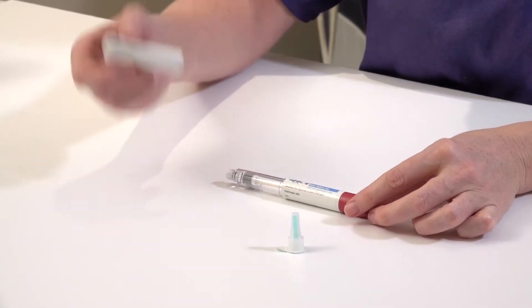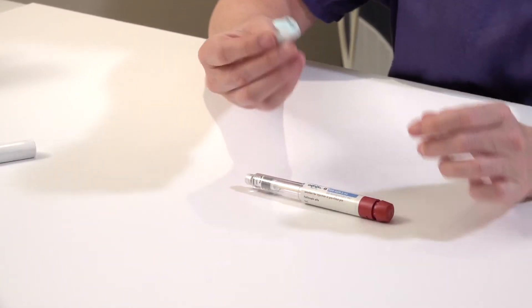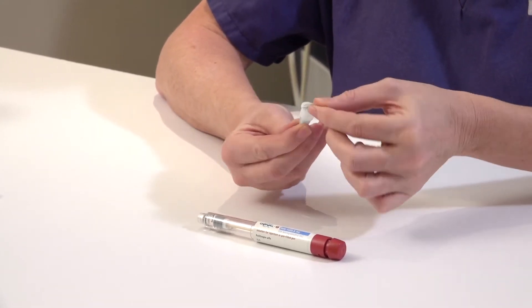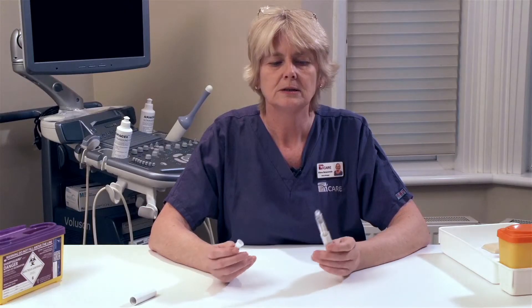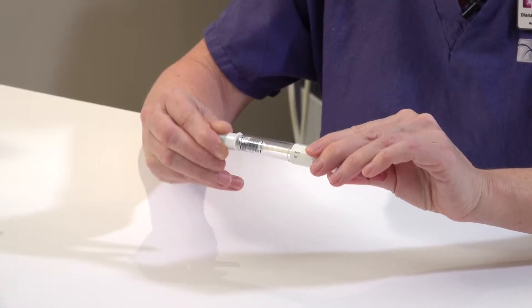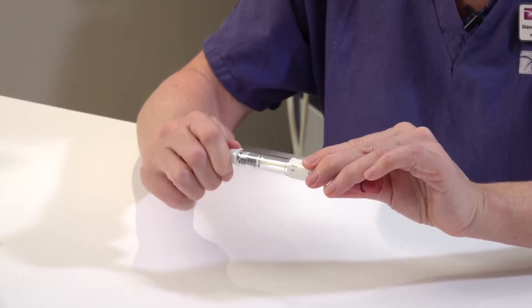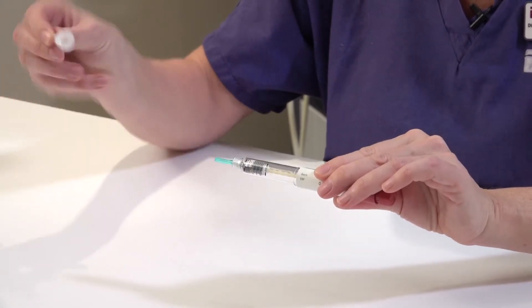Firstly, remove the lid from the pen. Take a needle from the box and remove the paper cap. Insert the rubber bung end of the pen into the needle and, as you insert, twist and screw the needle onto the top of the pen. Remove the outer cover.